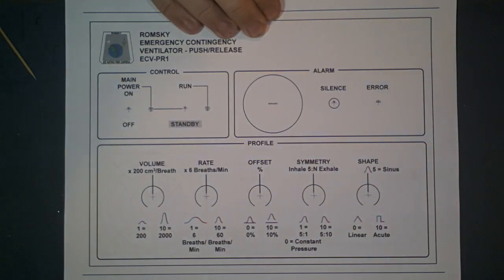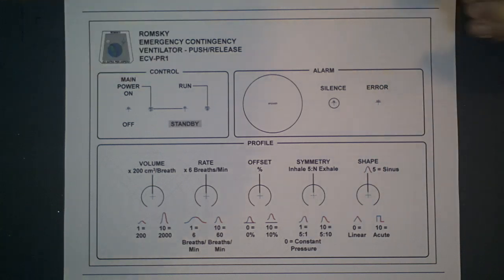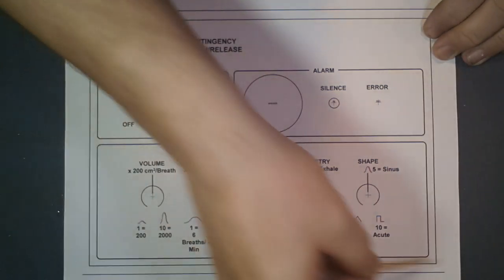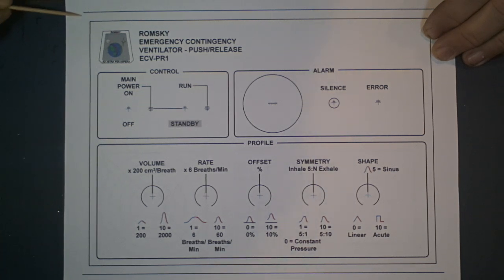All right. So this is the front panel. Again, it's drawn 1-to-1. You may see that some edges are cut off. It doesn't matter. I'm lucky. When I draw on PowerPoint 1-to-1 and I print on my particular printer, it comes out exactly 1-to-1. So I don't have to do any scaling of my printouts. And I drew things a little bit bigger just so the edges came off. But these lines here are where I'm going to cut the plywood when I'm done.